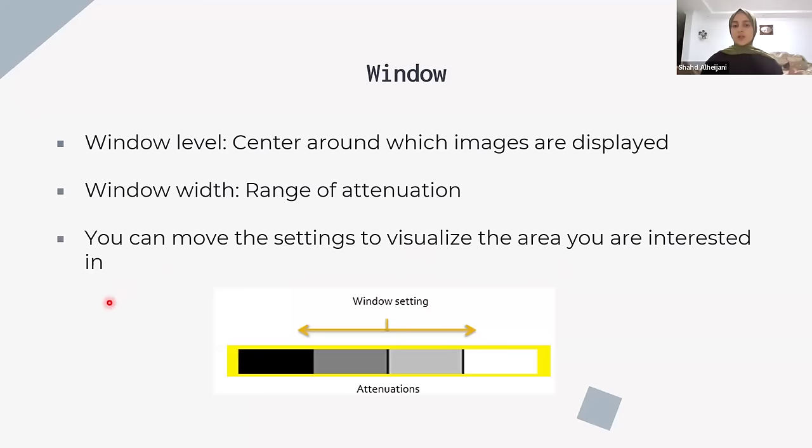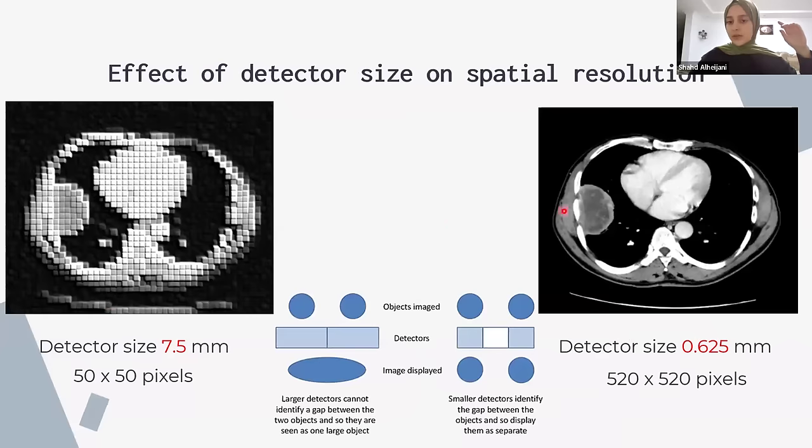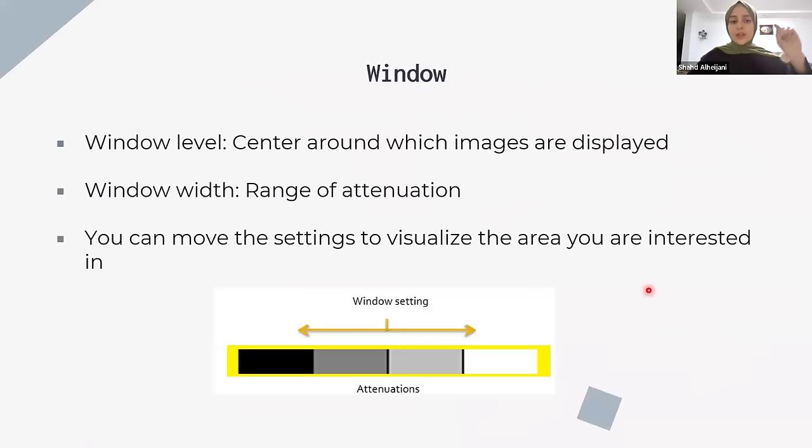see more structures. For example, if you look at the normal CT, you'll be able to see the different structures. For example, in this one, you'll be able to see the bones, the heart, the different organs, the aorta, and so on, the muscles at the back. But sometimes you adjust the width or adjust the level or adjust the window to see specific stuff.